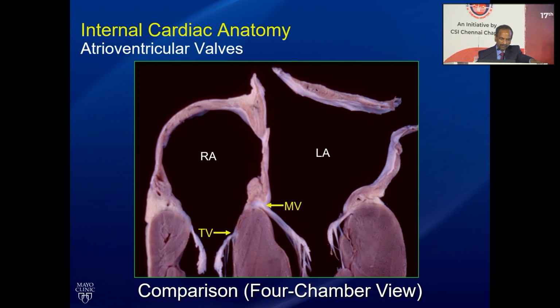So, some points about locations and ablation of pathways. Pathways are on the annulus, so you will ablate on the annulus. Very important: you don't ablate the ventricular insertion or atrial insertion. You ablate on the annulus. On the annulus, the signal you will see is some V, some A, and the pathway potential. If the pathway potential is recognized with contact, even the most difficult pathway ablation will be successful.